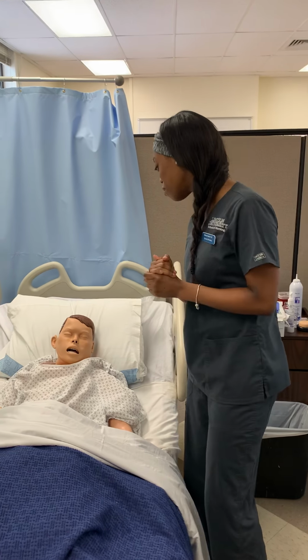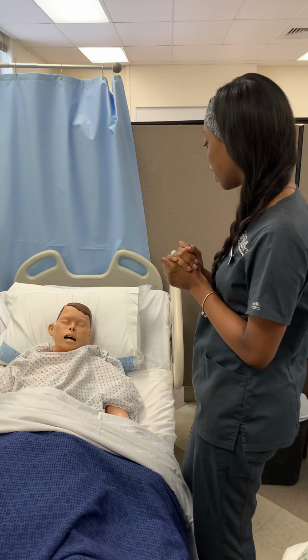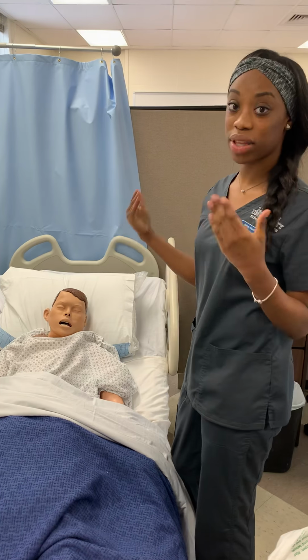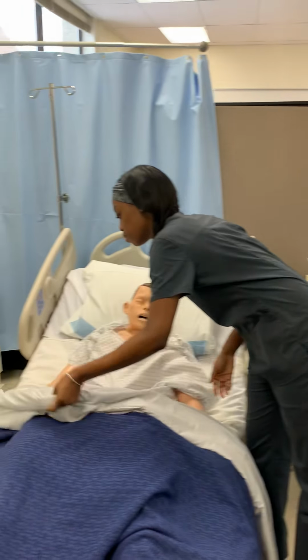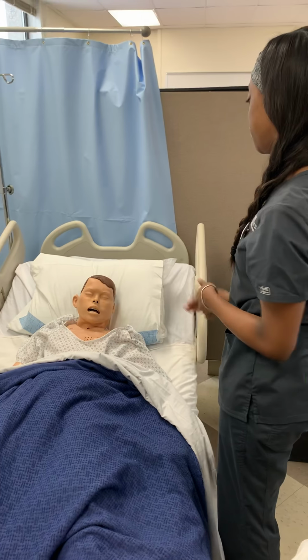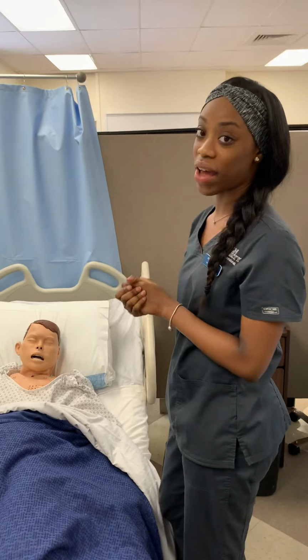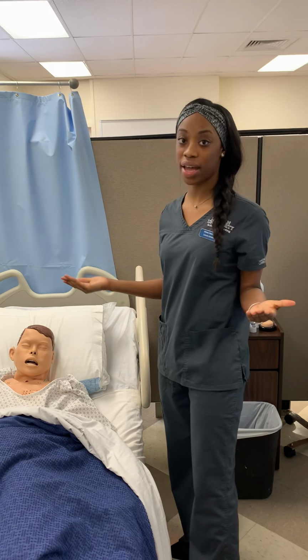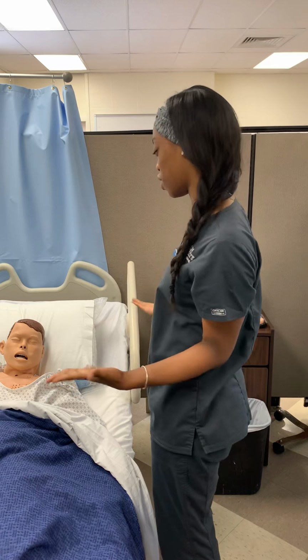Hello, my name is Sydney, and I'll be your nurse for today. Can I get your name and date of birth? Then I will match that with his ID band. All right, Mr. Livingston, how are you today? I'll ask the last time he voided and if he had any difficulties, which he's had, and that's why he's receiving this catheter.